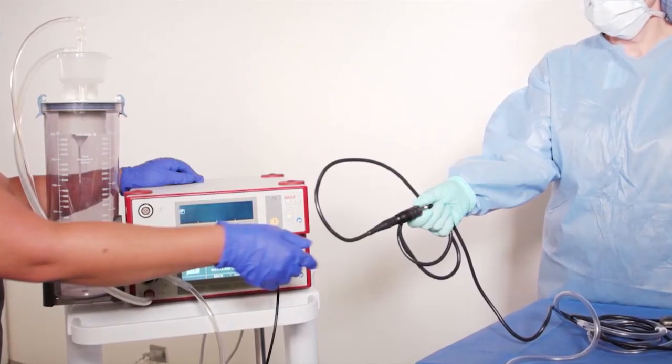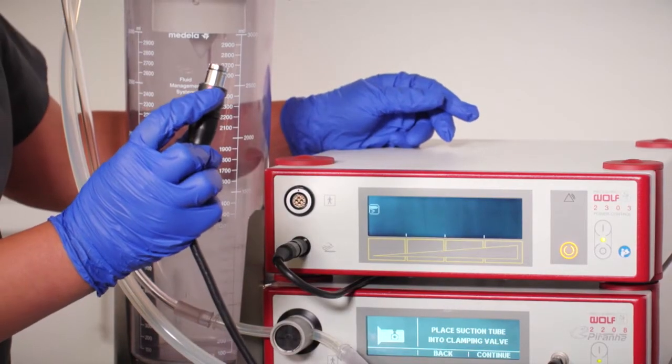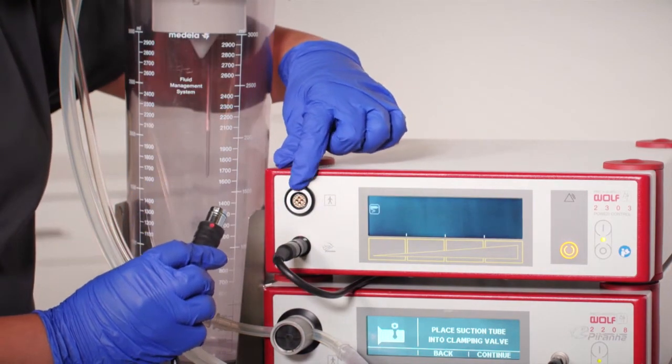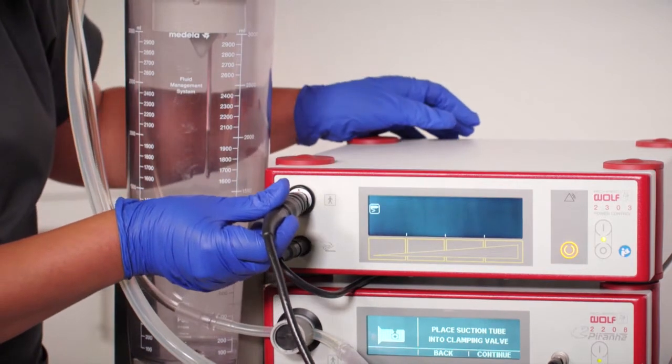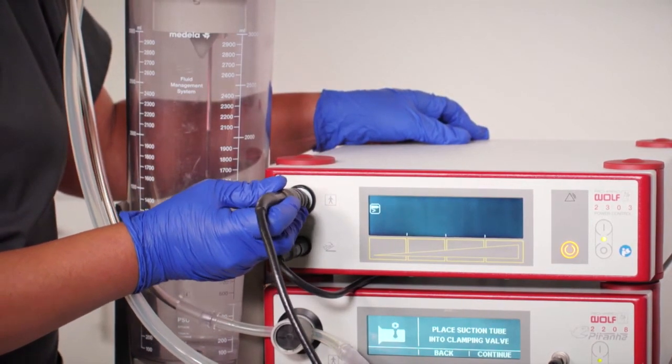The sterile team member may now pass off the larger end of the connection cable to the non-sterile team member. They will now align the red dot on the handpiece's connection cable with the red dot on the motor unit, pushing straight in without twisting. Note the change on the screen of the motor unit.